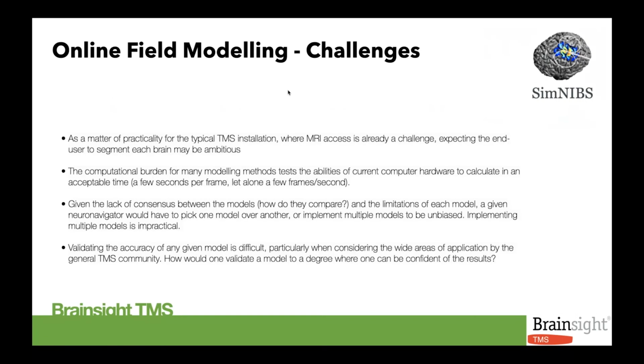Before getting into it, obviously there were some challenges that we faced before we could incorporate it, and some questions that needed to be asked. It's hard work. It's not the easiest thing, current flow modeling. And then should we bring that into a Neuronavigation software, we have to decide why we would choose one over the other.